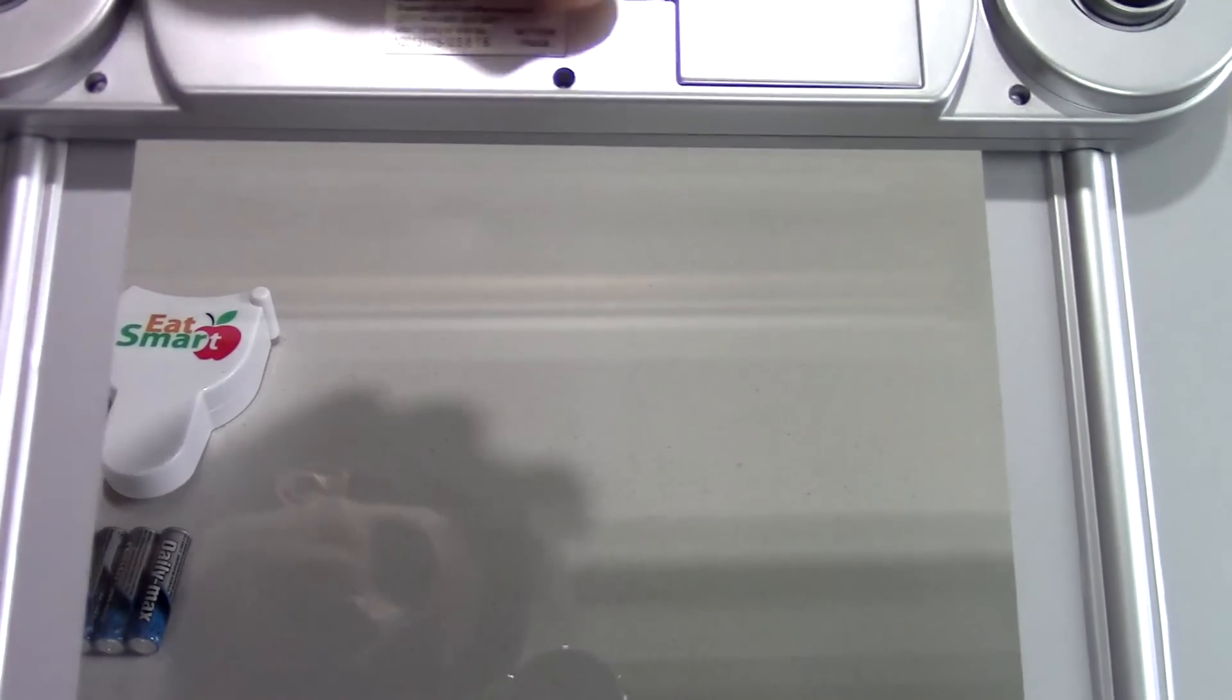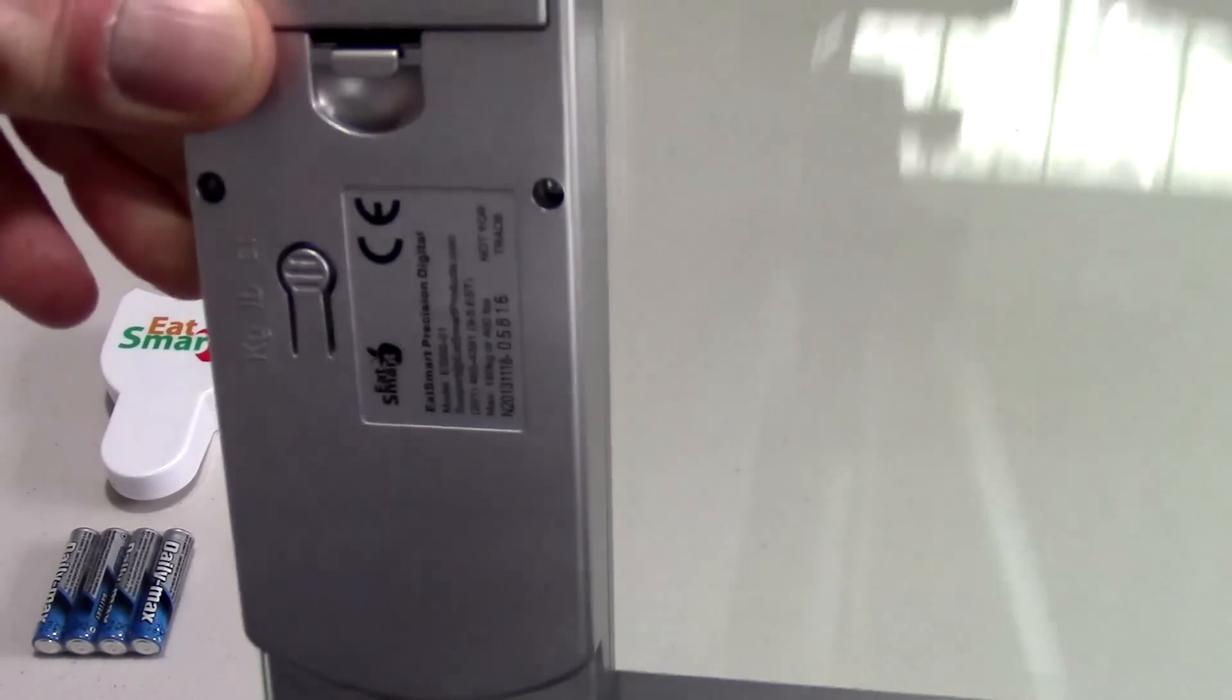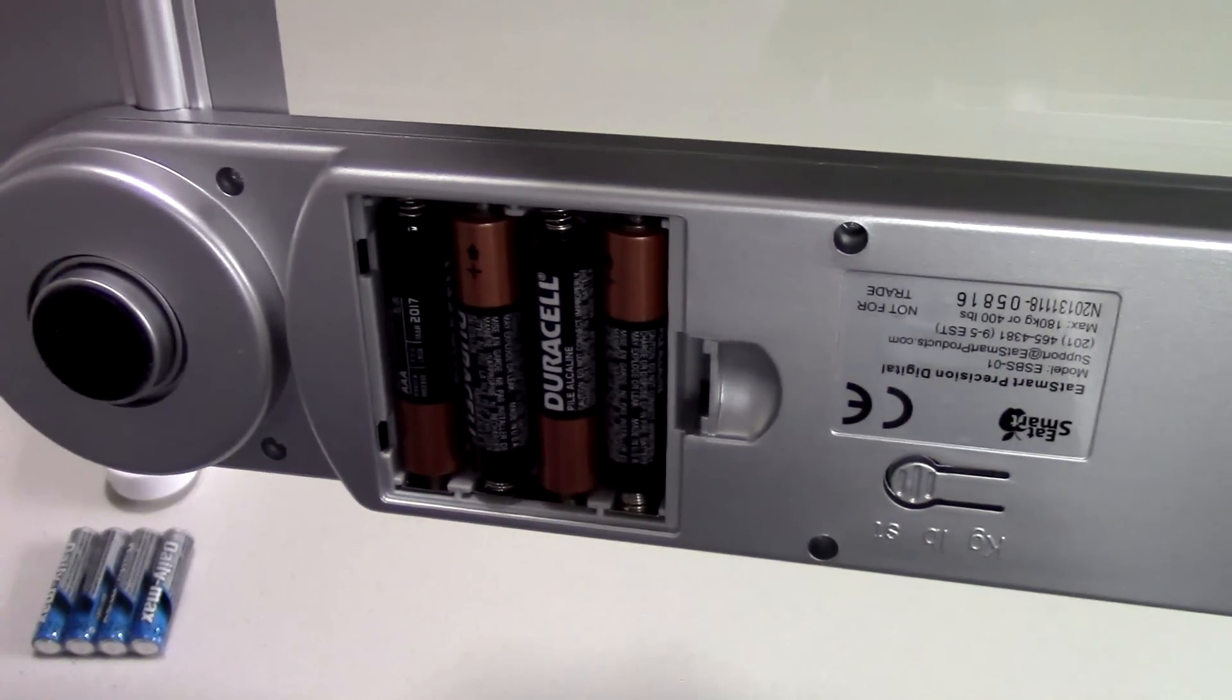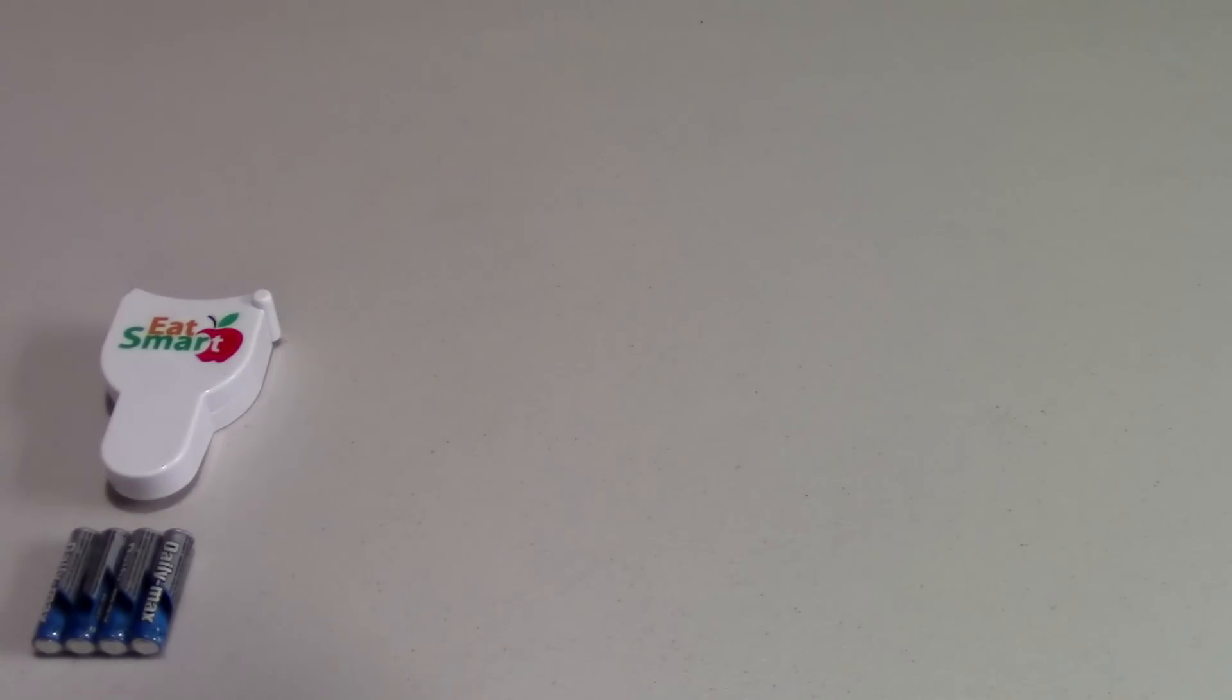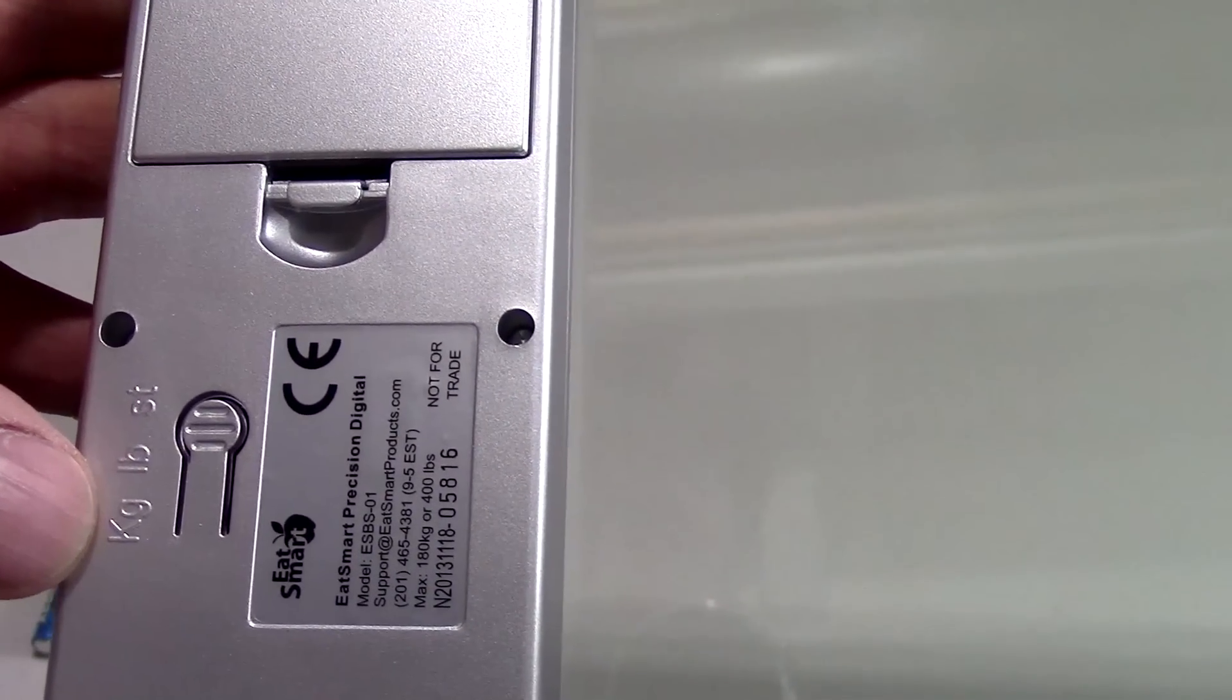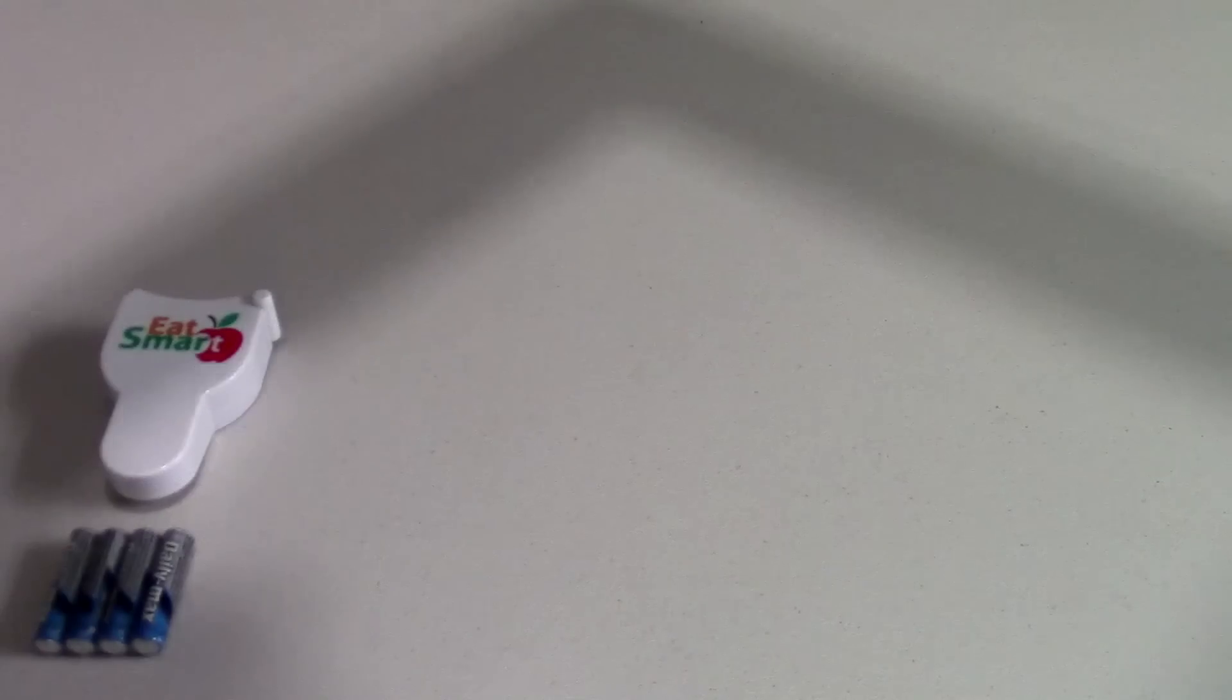I'll go ahead and zoom in a little bit more here. Right here, you can see where the battery compartment is. And we can go ahead and open this up here for you real quick. You'll see we went ahead and put some Duracells in there. And over here on the back of it, you've got your selection for kilograms, pounds, and stones. That's the weight measurements that it gives you.